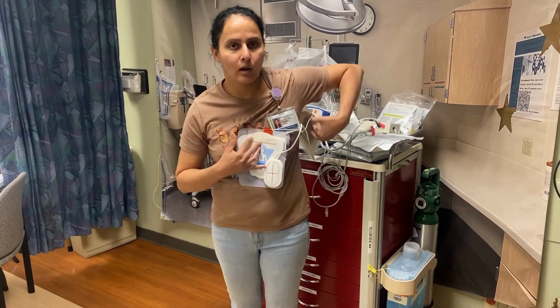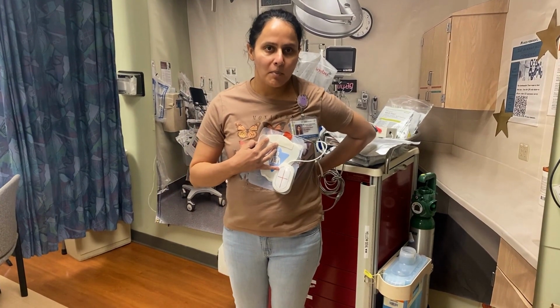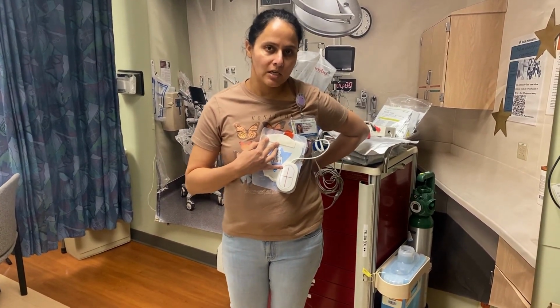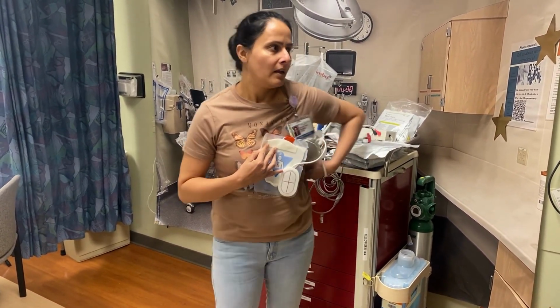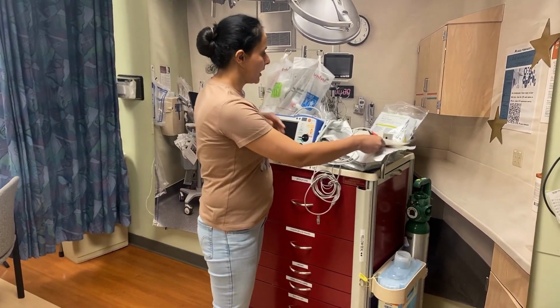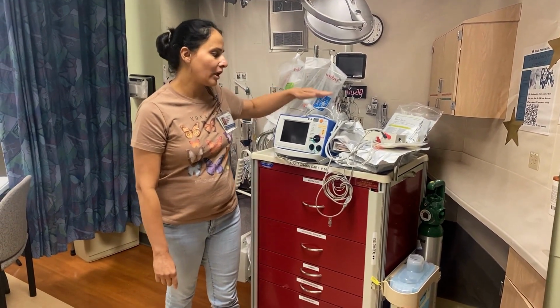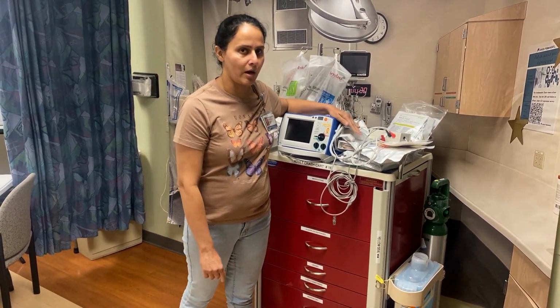When we put them on the monitor, these pads, the one goes in the front at the heart level and the second one goes on the posterior at the same level. So we make a sandwich of the patient's chest to pace them. And make sure these patients, along with the pacer pads, are connected to the 3 leads of the Zoll monitor, so when we get the capture, we can observe it on the monitor.